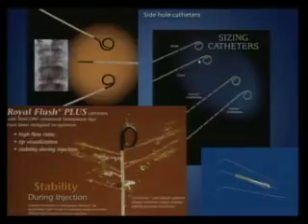This is a cava catheter, which is at 3 centimeters because more than 3 centimeters or 2.8 centimeters is a mega cava. So you cannot put the majority of the filters in a mega cava. So whenever you put a filter in the cava, you actually do a venogram. You measure with this that the cava should not be bigger than this.